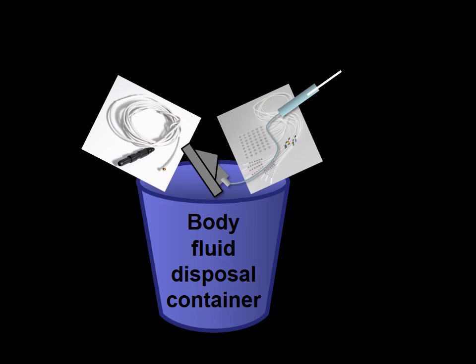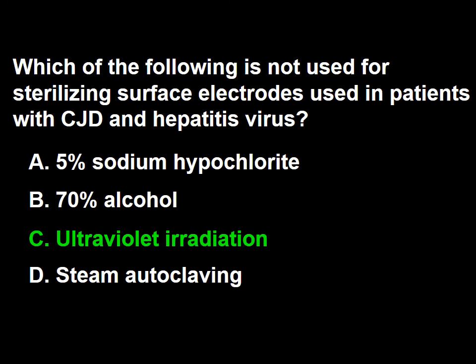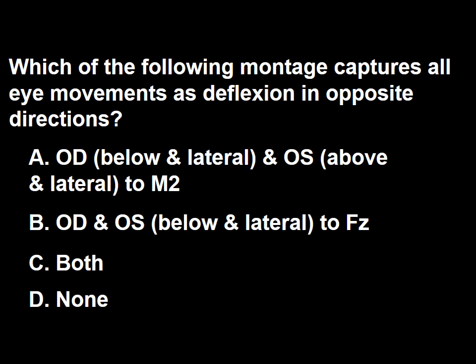But remember, if in the answers you find an option that is disposing of the electrode, then that would be the correct answer for all surface and non-surface EEG recording, regardless of the status of the patient. So the answer to this question is C.